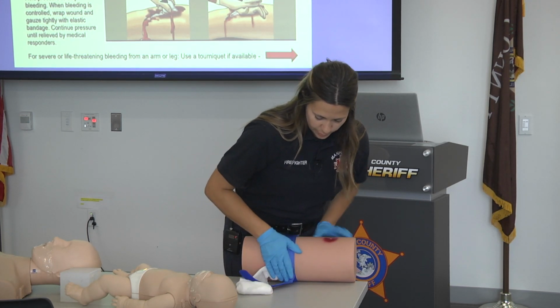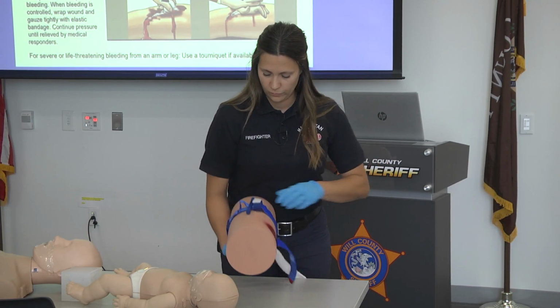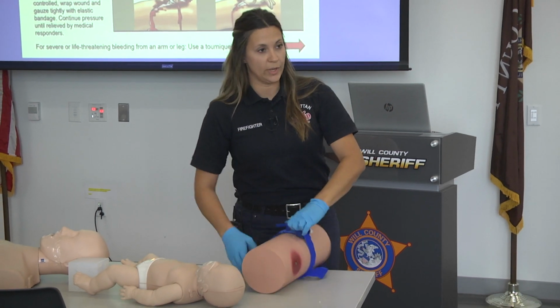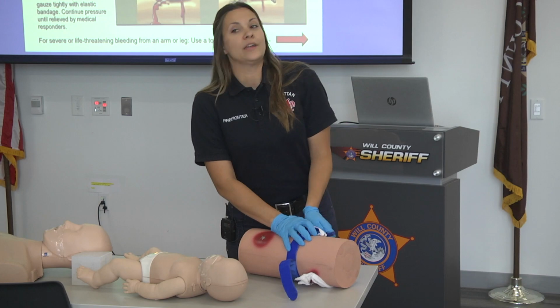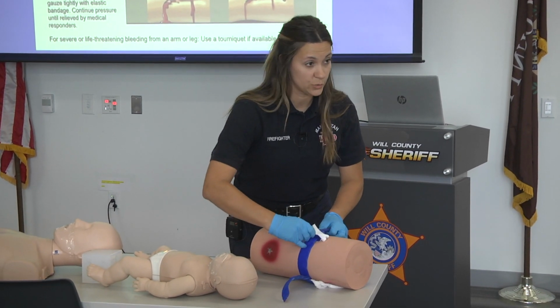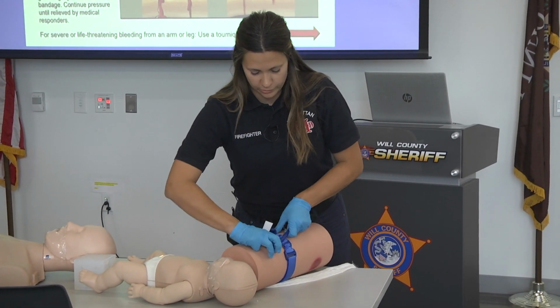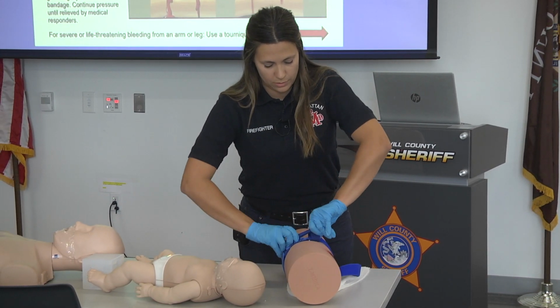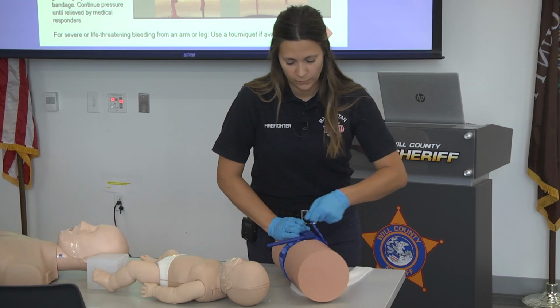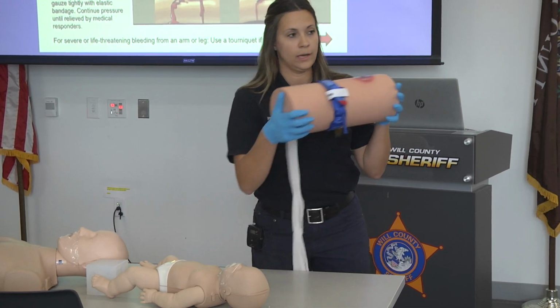You'll put it on the person, depending on the location. Then you're going to take this little plastic piece here, and you're going to twist and twist and twist and twist until it's tight enough. You can't twist it anymore. My Velcro's a little too tight there. Then you're going to clasp it. And you'll write the time that you put the tourniquet on the tourniquet.